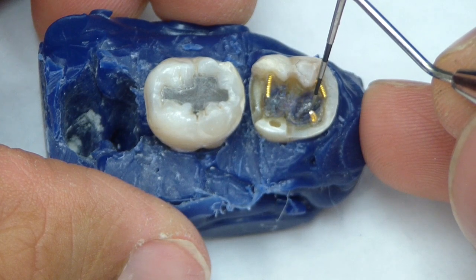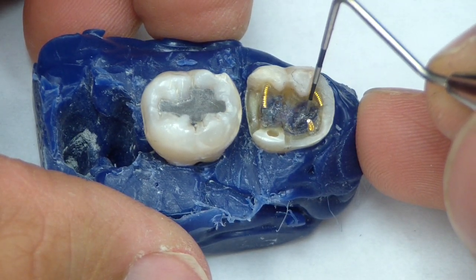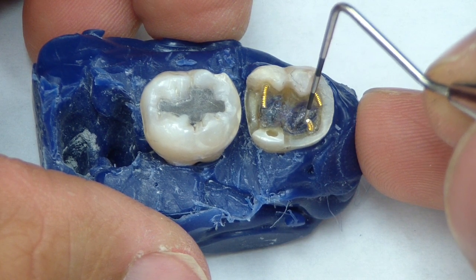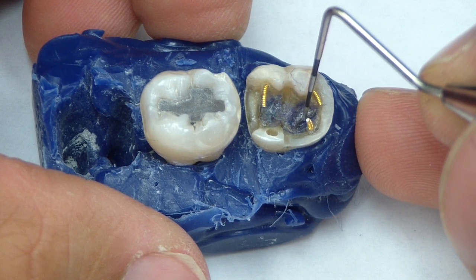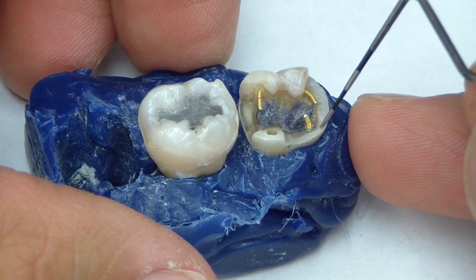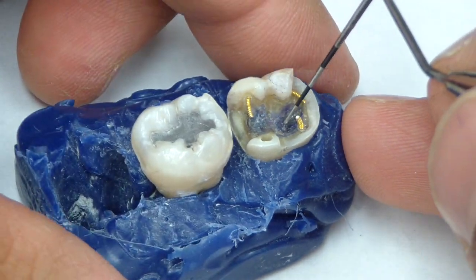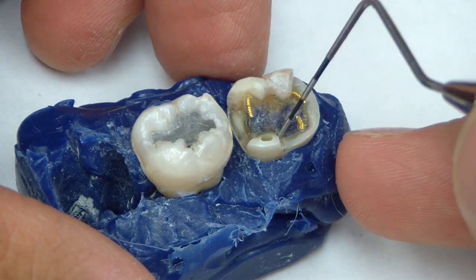Another thing to note, as Dr. Dre had mentioned, is that on the radiograph you'll be able to see there was tertiary dentin formed. So there'll be a thicker amount of dentin between the pulp and this margin and the surface of the dentin — giving a little more protection when you go to place the pin rather than perforating into the pulp horn. There is no pulp horn, so that's another key point.